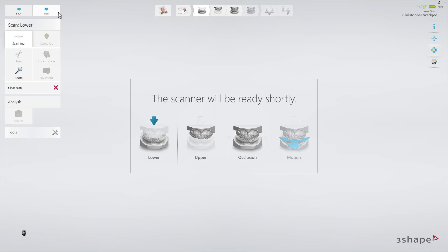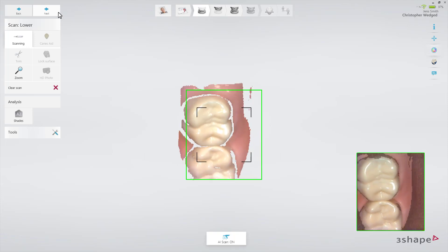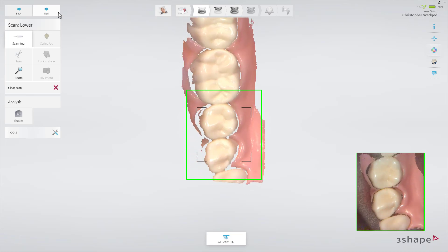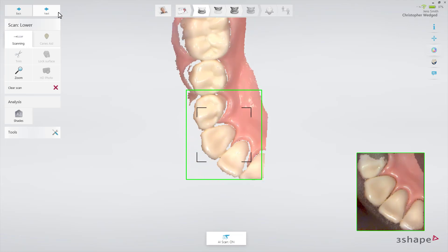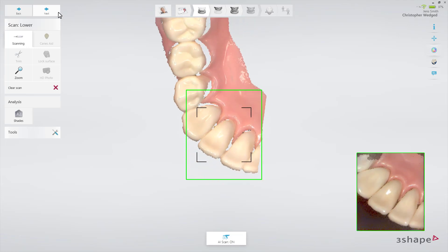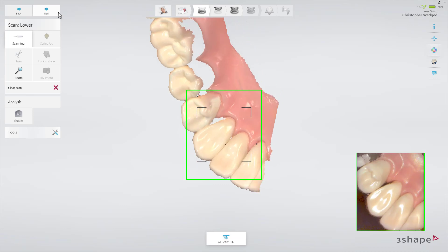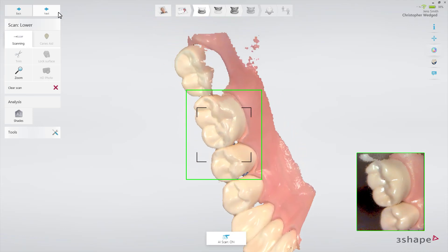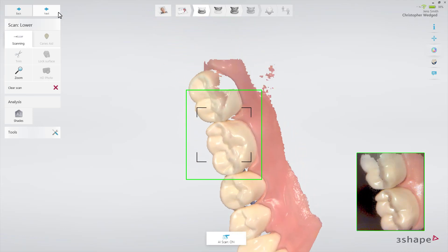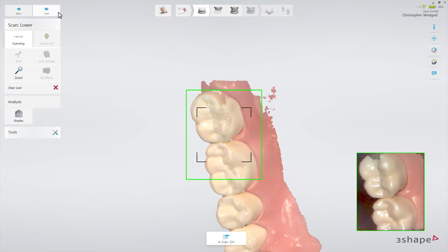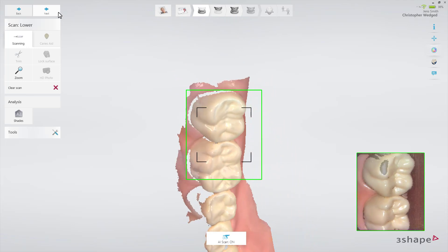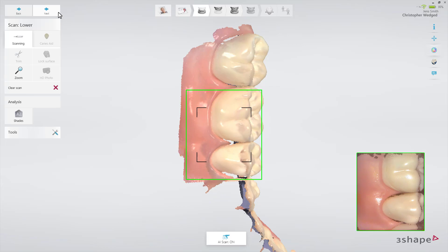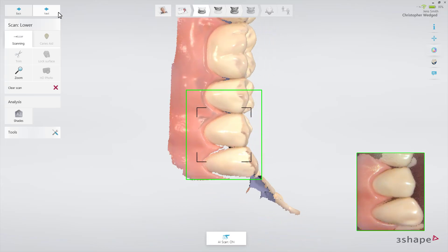Follow the official scan strategy, which is to start by scanning the occlusal surface from the molar to the canine. Then, as it is the lower arch, slowly roll to the lingual side and move the scanner in the distal direction. Finally, slowly roll over the last molar and scan the buccal side.